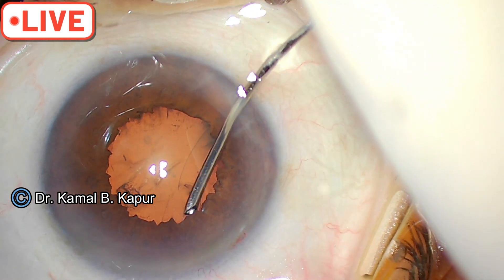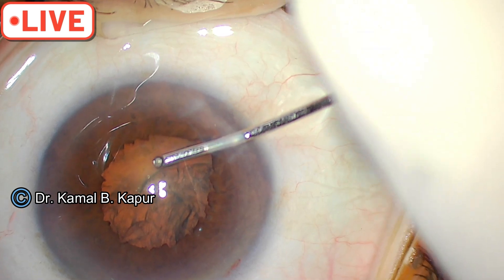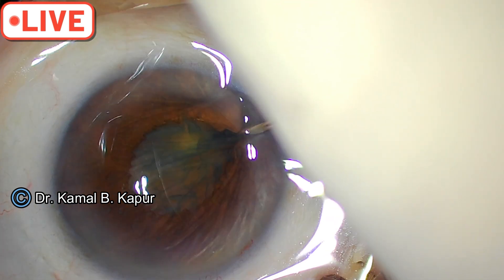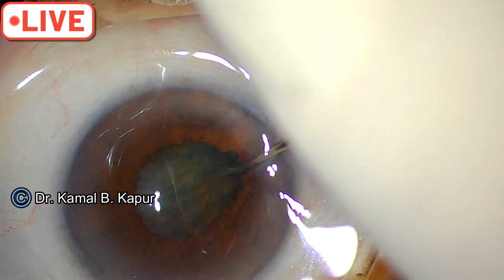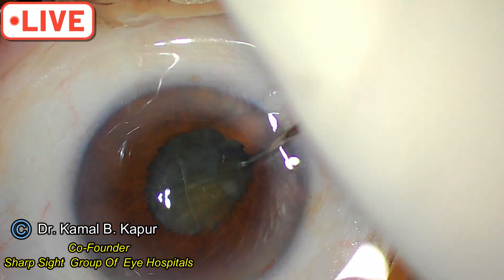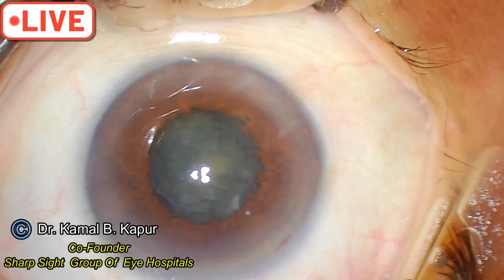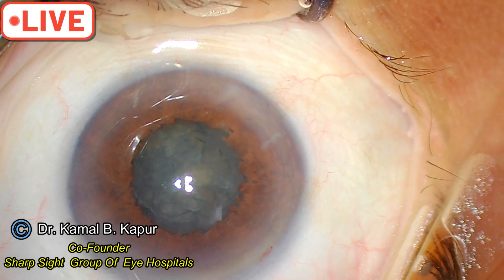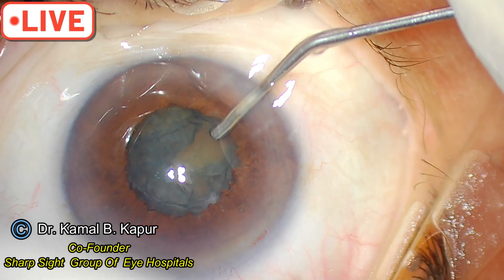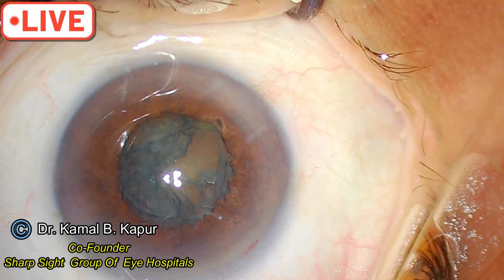Now do a cortical cleaving hydrodissection — you saw the wave. Since it's a floppy pupil it will tend to come out and be pulled by your IA or your FACO probe. Make sure you rotate the nucleus well. Before you go in, push the viscoelastic downwards to push the iris back, because this is a floppy iris and it will tend to obstruct your FACO tip as it goes in.